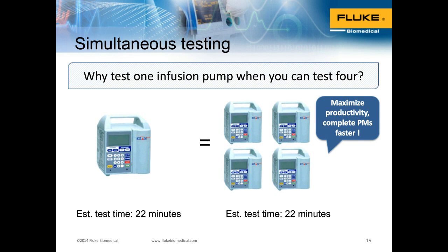But generally what we see is the bench setup that I described earlier. We have seen multiple organizations essentially churn those pumps very, very quickly, because once you have the basic layout in place, you're basically doing flow measurement and occlusion measurement very, very swiftly by testing simultaneously. So that should not slow you down at all. Once your setup is complete, it's almost like an assembly line where you're putting pumps through the preventative maintenance procedure fairly quickly.